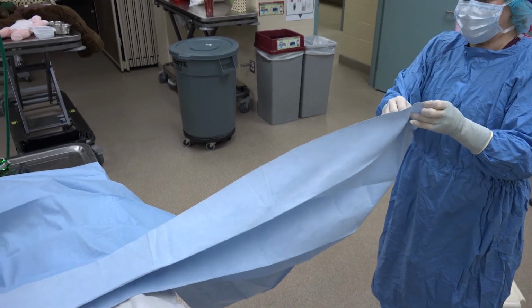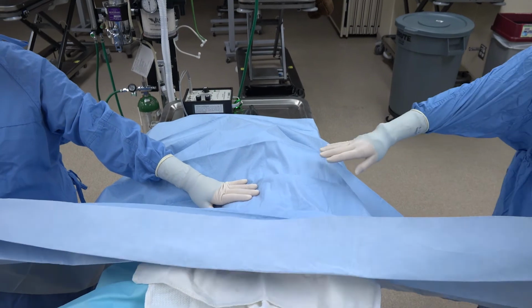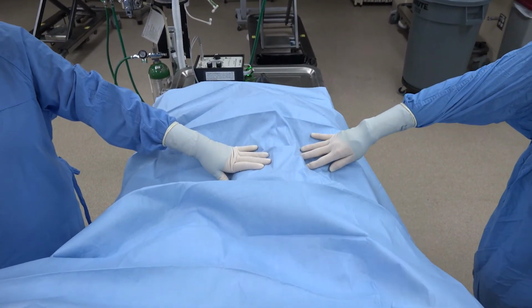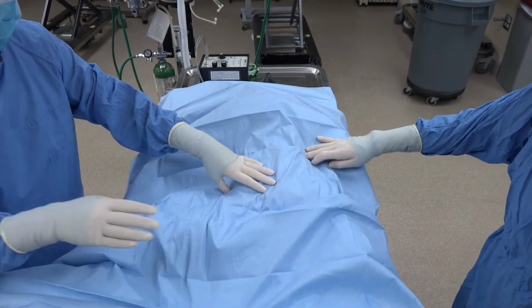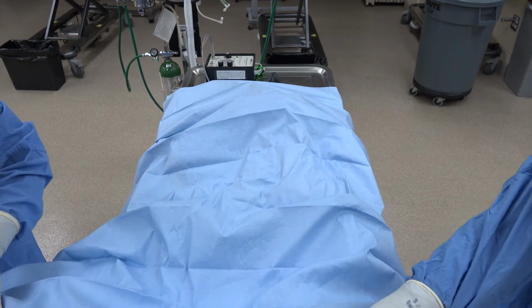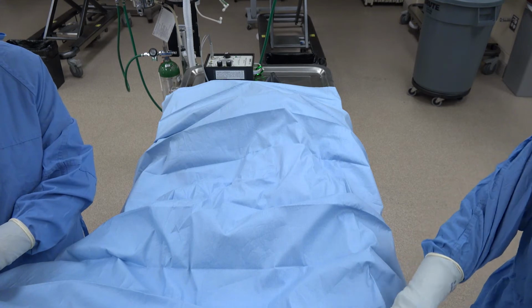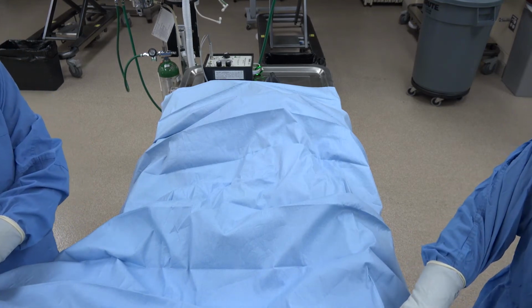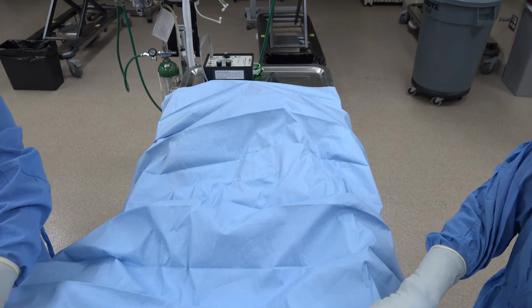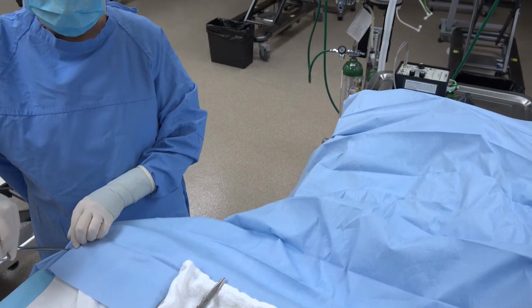All right, so now I'm going to steady the drape so that it doesn't get displaced, and we're going to do the other side, and we're going to go all the way to our instrument table. And so then once it's on the instrument table here, we're going to replace the instruments so they're on the outside there. And then to attach it to the table, you cannot use a penetrating clamp because it's not sterile. We didn't sterilize this table, so we can't put a penetrating clamp on it. So I'm going to use my Allis tissue forceps to attach this drape to the table so it doesn't fall off.